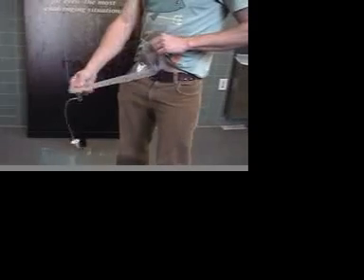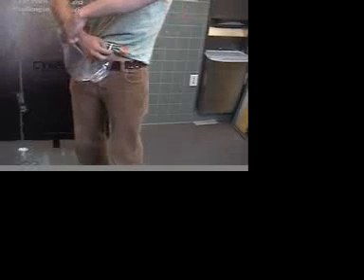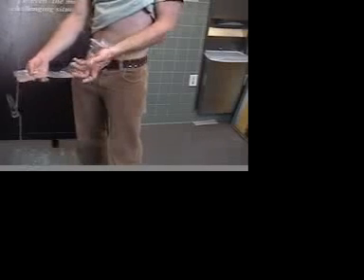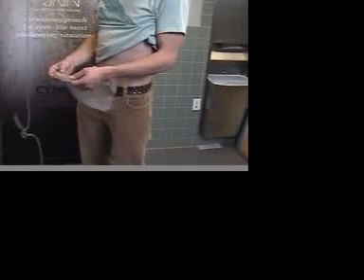And I'll get up from there, move and sit on the toilet, just holding both ends of this in case there's any output while I stand up. And I will roll this top part and fold both ends in like so, and then drop this end of the sleeve into the toilet. And I'll sit there for about 10-15 minutes, and I'll start to have output. Once I feel my system's ready for the next bit, I usually put in another half liter, and that works best for me.